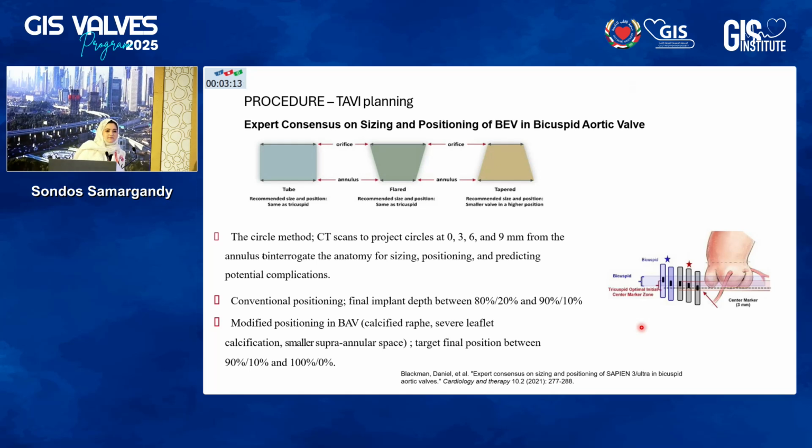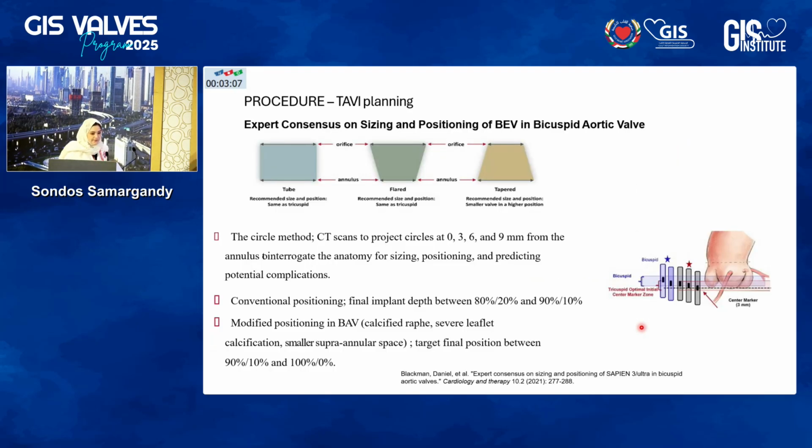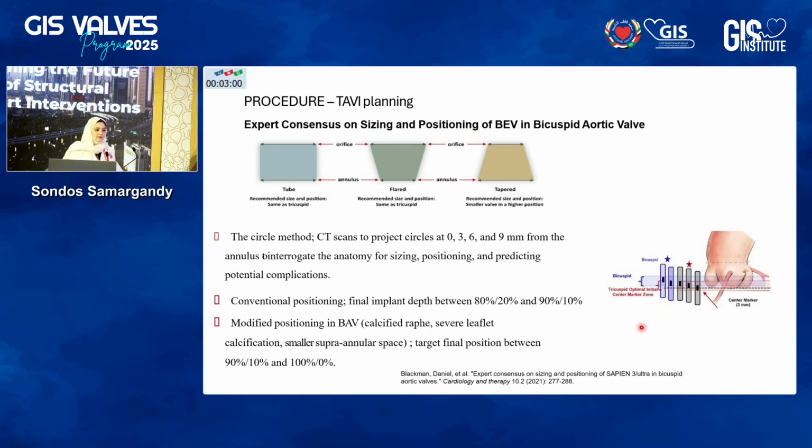So if you go low, you may end up with the paravalvular leak, maybe significant, or under-expansion of the upper part, which has the lowest radial force in the valve, because if you use the balloon expandable, the radial force is at the crowded or the horizontal honeycombing down in the frame.